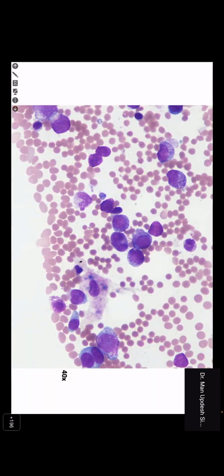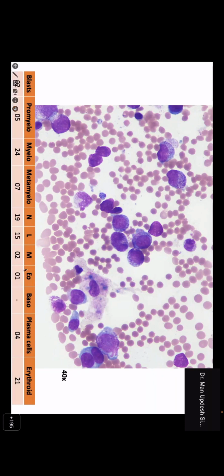So what's that cell? Fuzzy borders. It's some sort of cytoplasmic. This could be a macrophage. Yes, that's the macrophage. So you see there are normal hematopoietic cells and some plasma cells. I'm also showing you some histiocytes. Basically, what I'm representing here is that there is some reaction in the marrow. Some cells show stronger, coarser, more prominent granulation. So overall, the marrow is reacting to something, with the presence of plasma cells and histiocytes. And that's the differential for you.